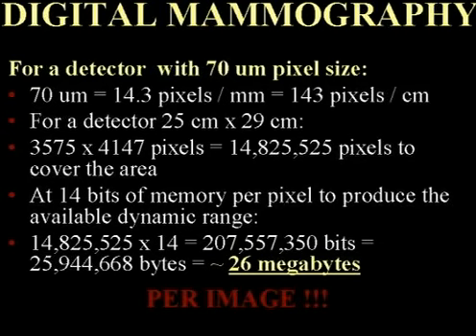That means a standard mammographic examination of 4 images will come in at about 100 megabytes. And now think about doing 100 women a day. This is an incredibly huge amount of information, and really the translation to digital from the analog world really rested in part upon 2 things: the development of the full field digital detector and the ability to handle this amount of information in an efficient way.